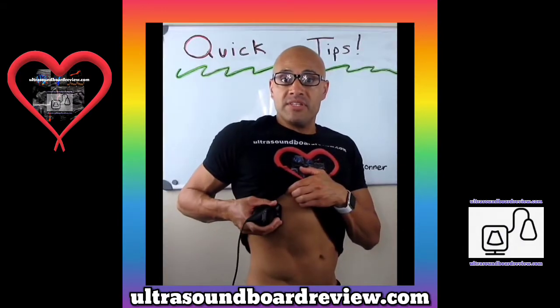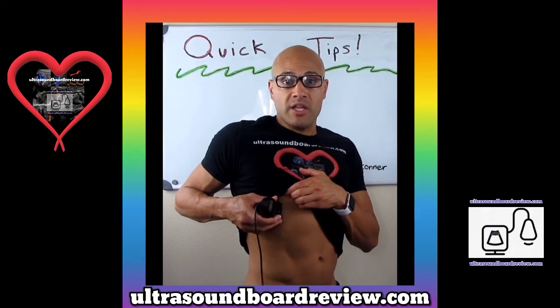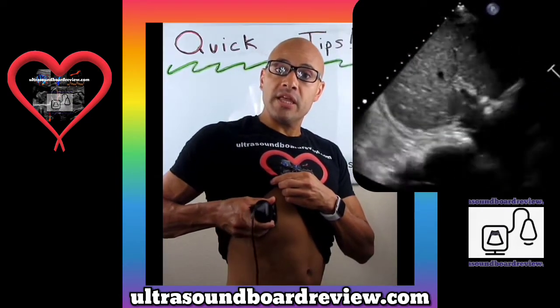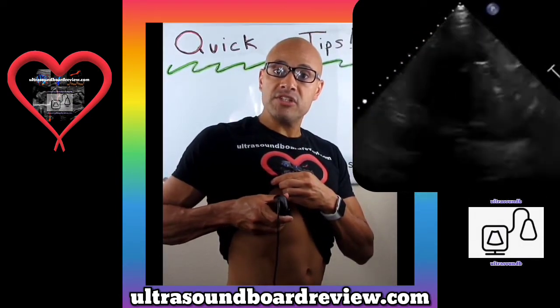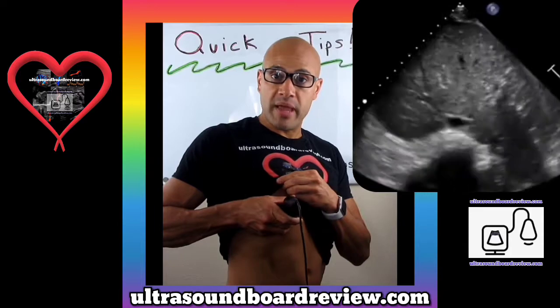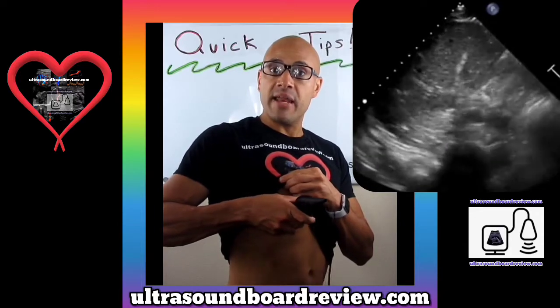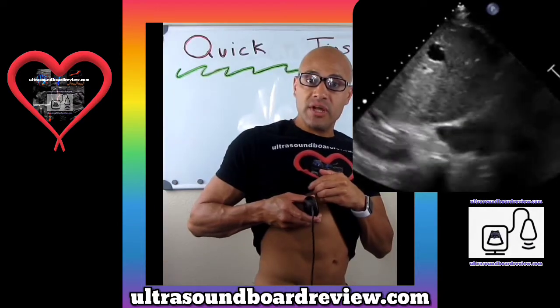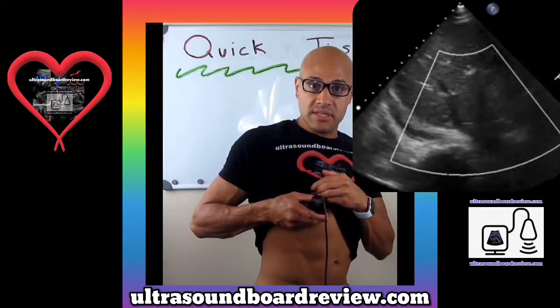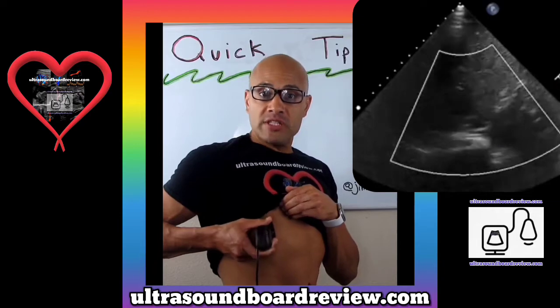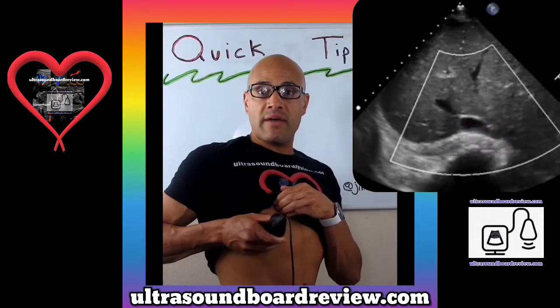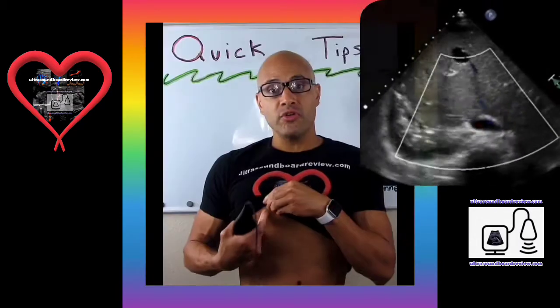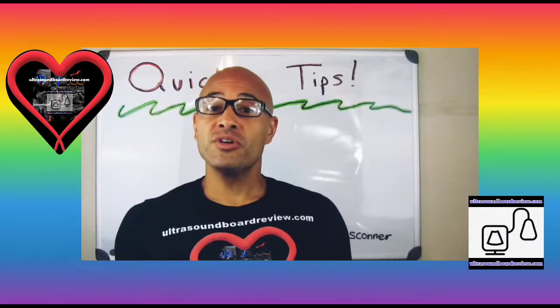Sometimes you'll see the IVC in this spot and you won't have to move anywhere else. You'll start by moving medially along the patient's intercostal space, fanning back and forth until you can visualize the patient's IVC. Your transducer shouldn't have to go any further than about three or four inches in from the nipple line.